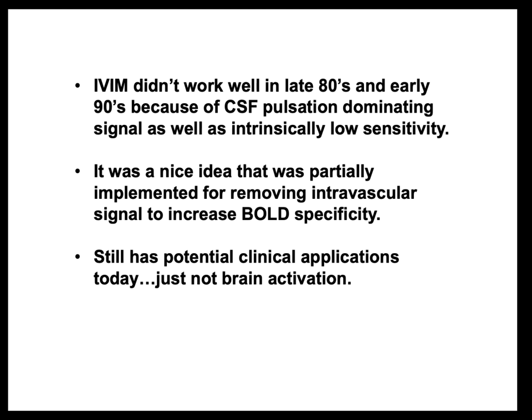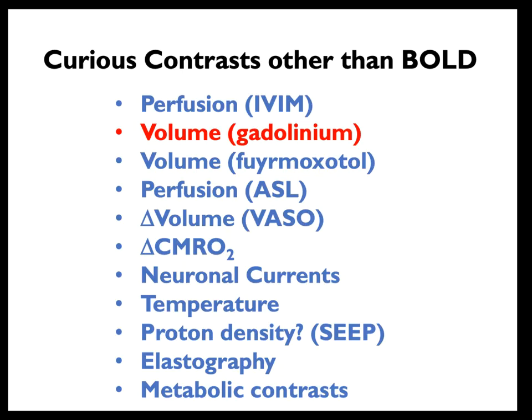But it was a nice idea, and actually, two days ago I mentioned one way of getting rid of intravascular signal is by adding diffusion weighting. And that essentially is the concept of IVIM that we're applying to get rid of the intravascular signal. So it's still kind of being manifest today. But it has many clinical applications, just not brain activation.